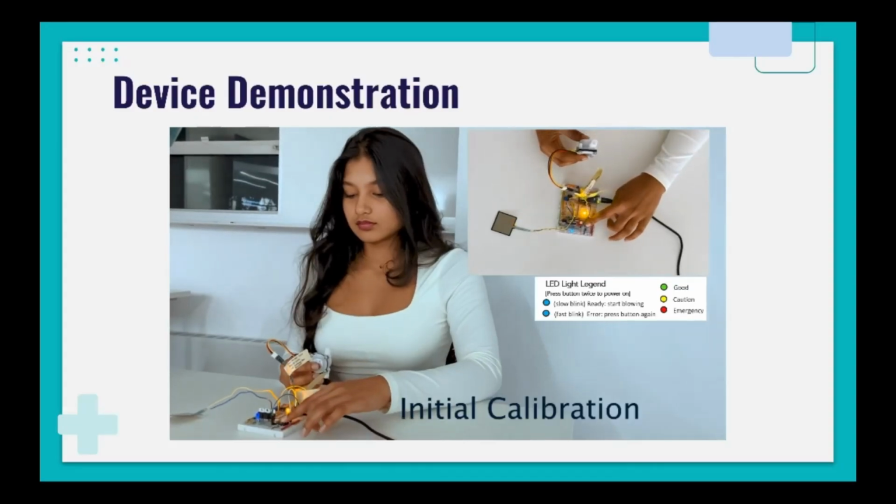Next, we'll follow with a demonstration of the PEF readings and the pressure sensor, then an explanation of the predictive abilities of our device and a demonstration of the gyroscope. Here is a video of our device demonstration.